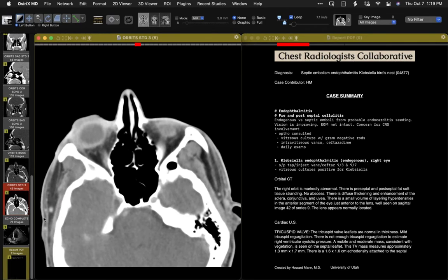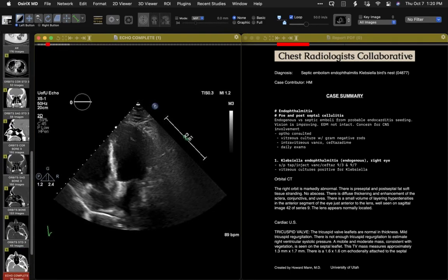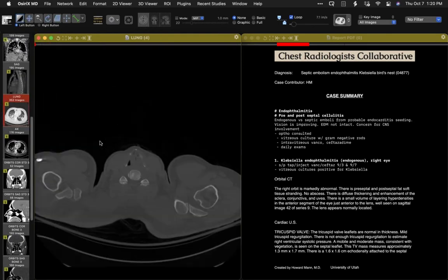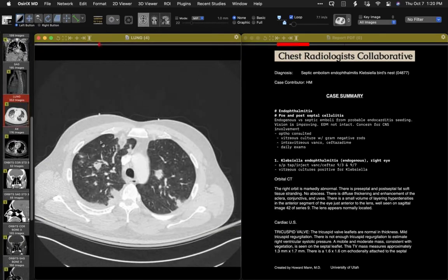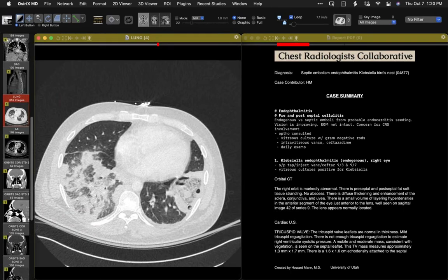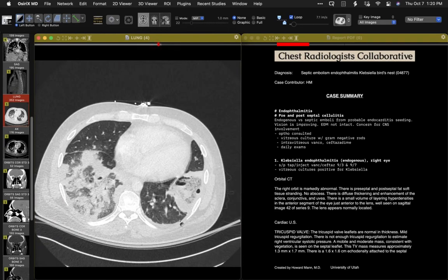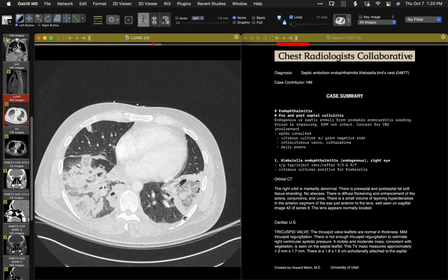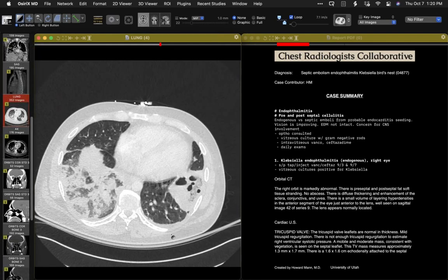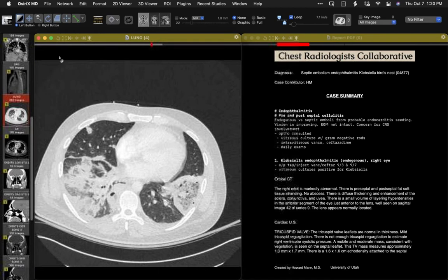Patient does have vegetation on a valve as well. So endocarditis, Klebsiella, endophthalmitis, and a very dramatic case of pulmonary septic embolism with many bird's nest signs, particularly large over here. I'm trying to recall if I've seen one as florid as this before with a bacterial organism, but I can't quite remember. I have a couple of cases of MSSA or MRSA basically leading to this. I just actually had one this morning. Yeah. Okay. Because you're showing it, I'm going to show it next. Great. Pretty dramatic.